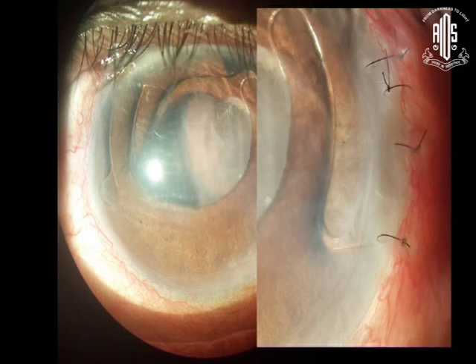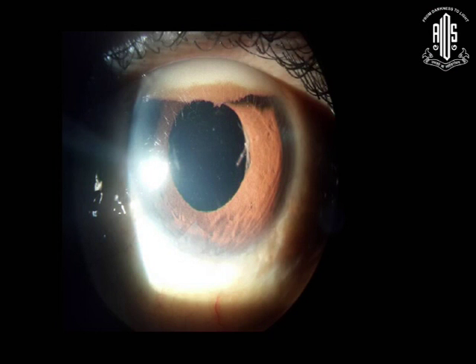This is a kissing choroidal. You can see the ora serrata here, and on this side also this is the ora serrata. It has bulked up so much. And when we look at the wound, you can see that the anterior lip and the posterior lip are here, and between that we have the haptic.